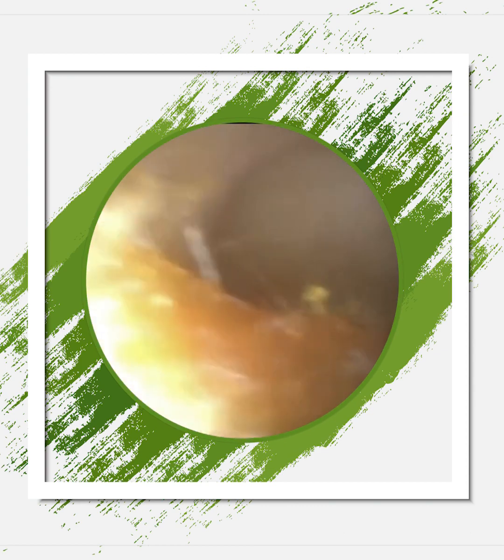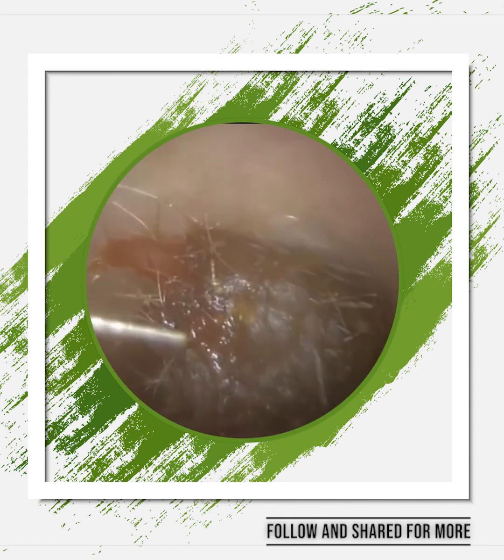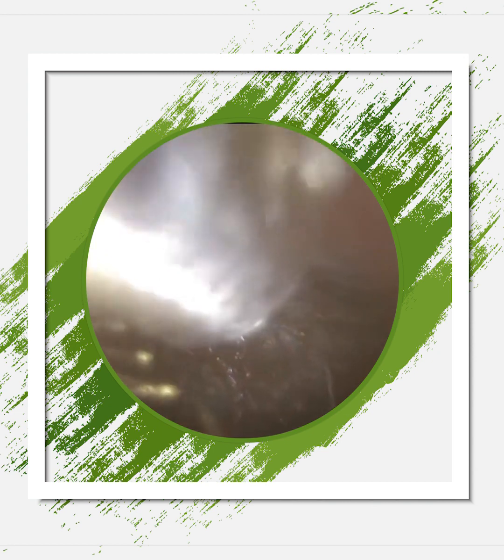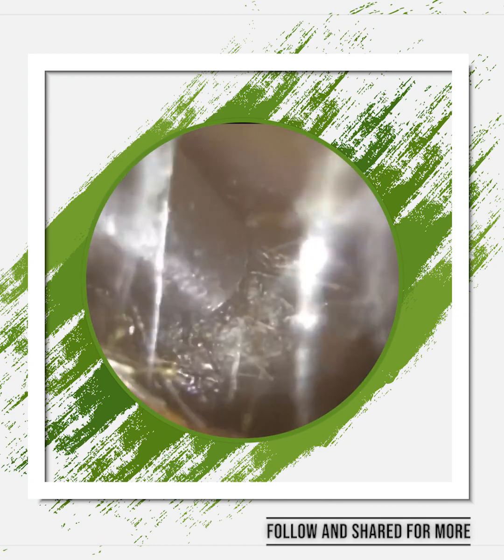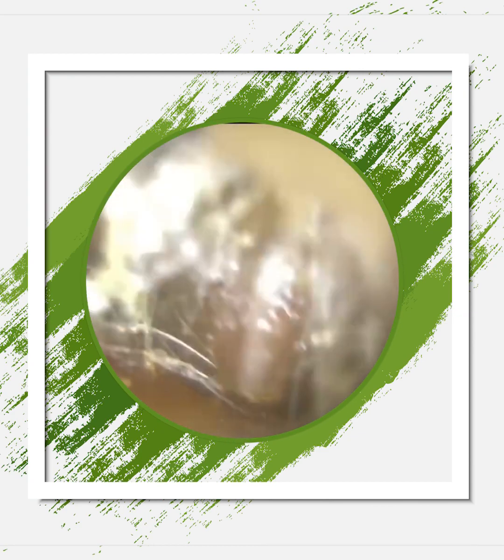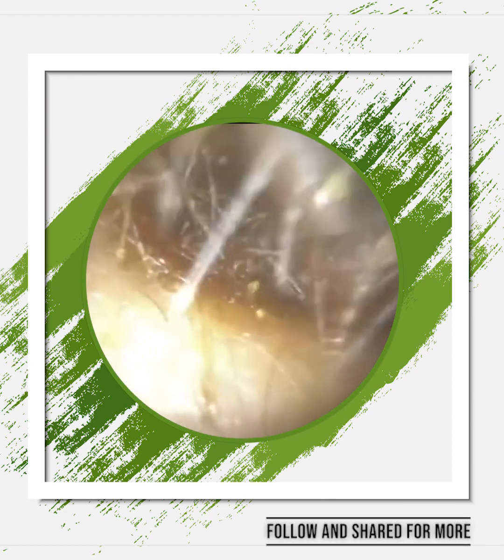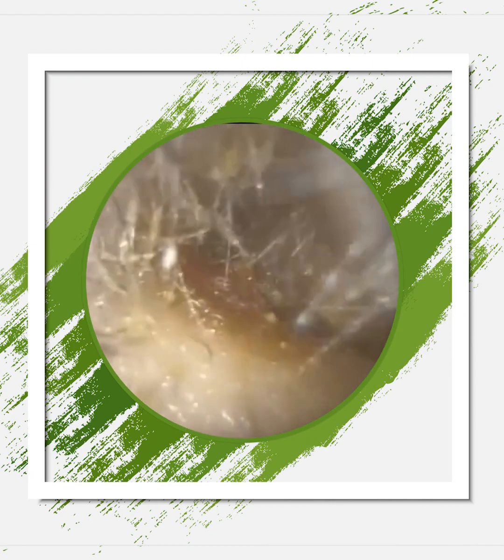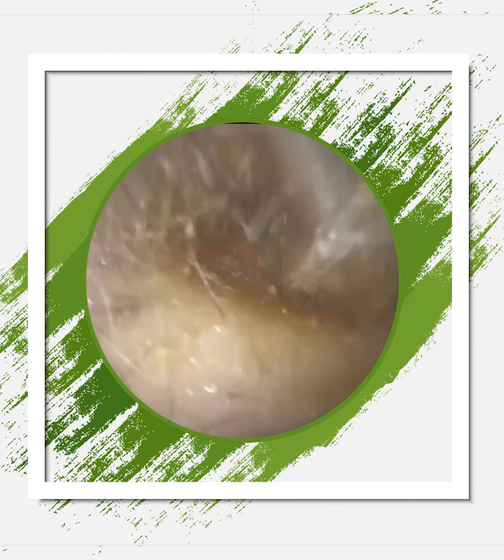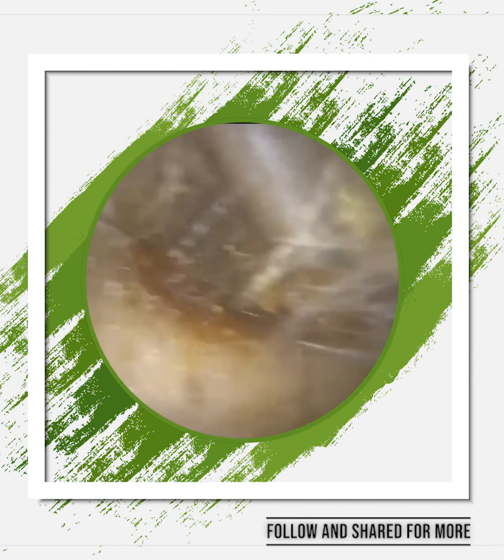So now I'm pulling the ear to the right and up, and I'm using the right hand side of the endoscope, and I'm stretching the ear to the right. And then whilst it's stretched, I'm looking into the ear, and I'm delicately inserting the sucker over the tip of the endoscope into the ear. And you can see how we can remove that wax very deep in the ear, and even from a very narrow and bendy ear canal. And you can see just how bendy it is now. So this wax, I brought it straight out, but then I'm now having to bend it to the left to get around this quite a prominent second bend.